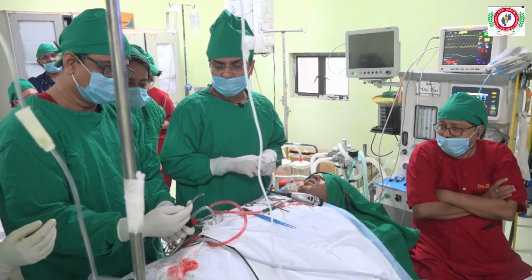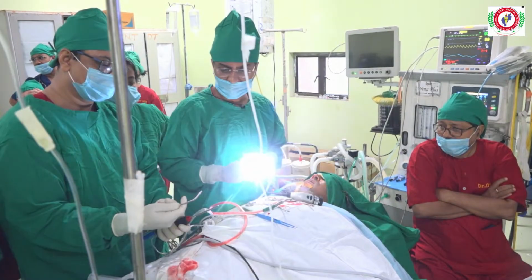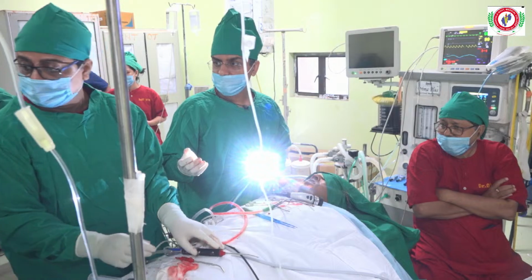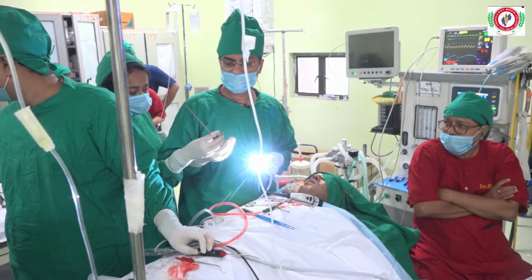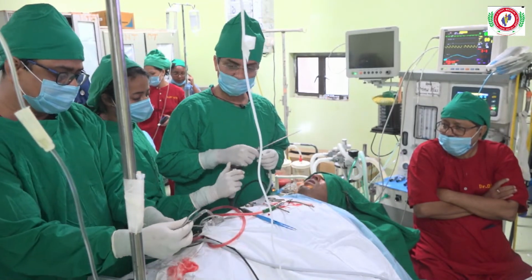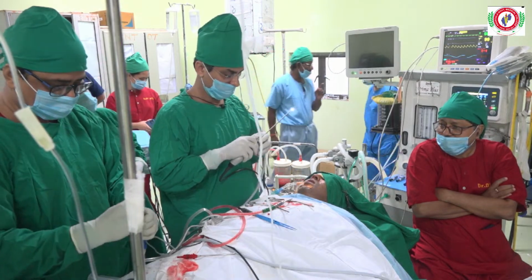Yes, so I need a 40 rad now and angled. We have a 45 degree scope and a 40 rad blade. But the problem here is this is an adenoid blade actually, we don't have a 45 rad blade. Give me a 45 degree scope.